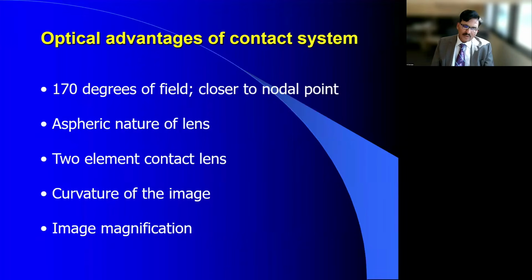And of course, that is important because when you use your microscope to magnify the image, the better the curvature of the image, the better your comfort level. For example, to avoid causing any cataracts, you can literally go to the opposite meridian without touching the lens because of the curvature of the image being nice and realistic and true.